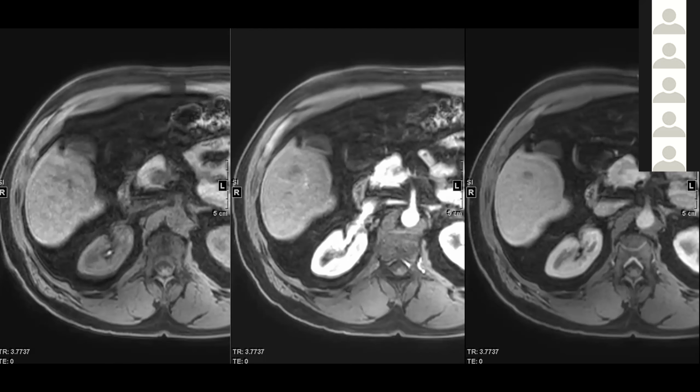Do you think it definitely became darker than it used to be? Which is my point, it's a difficult assessment to make. Rubel brought up comparing it relative to the liver parenchyma. Yes, I guess that would be another option, but that seems even trickier, because the liver parenchyma is changing so much between the arterial and the delayed. Right, so that was part of the discussion. If something goes from iso to definitely hypo, it's clear that there's been de-enhancement. But if you go from hypo to even more hypo, that's more subjective.